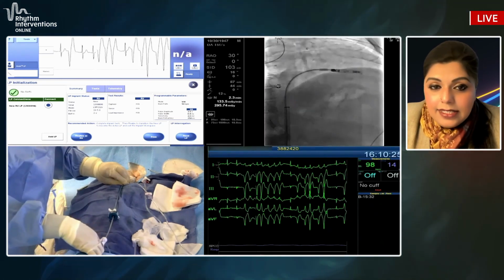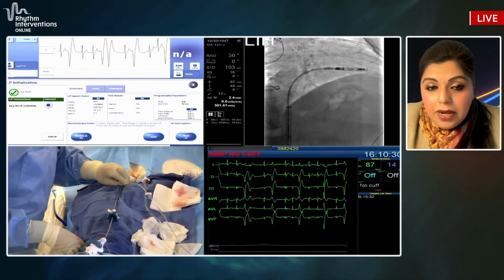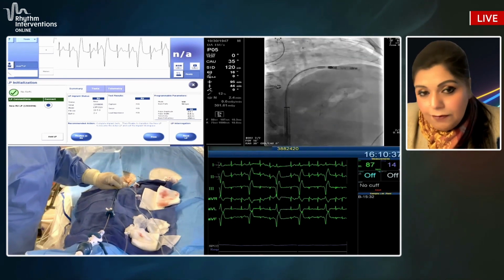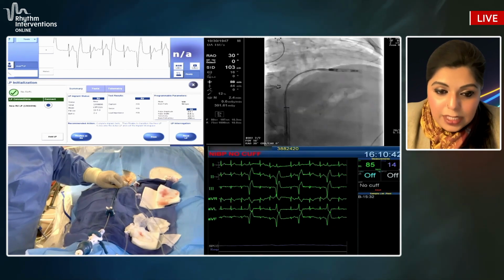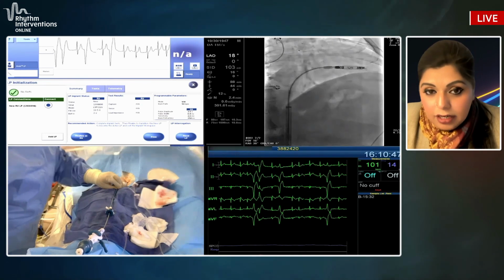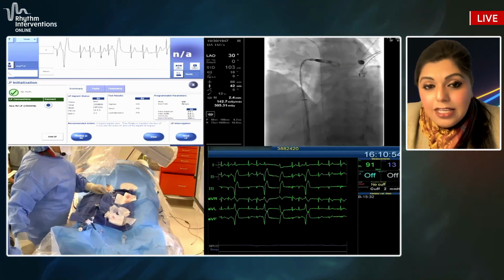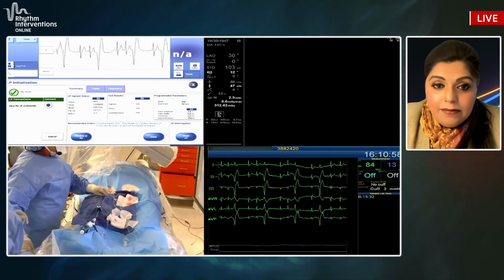But the key is to enter really low, and you can see that with the micro you're actually somewhere in the mid RA and kind of bending down, whereas with this one you're in the IVC RA junction and kind of advancing and deflecting as you're advancing into the RV. So a little bit different in that aspect. You want to make sure that once you enter the RV, you're kind of clocking into the septum. Because you enter low, and just the angle in which the delivery system works, it takes you really to the septum. And you can see I've gone to LAO to confirm that I'm septal.